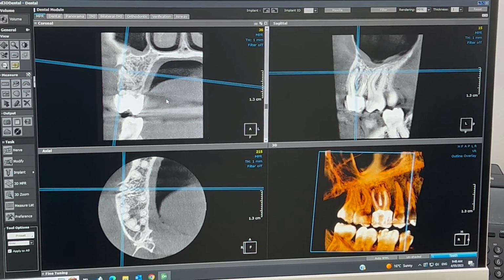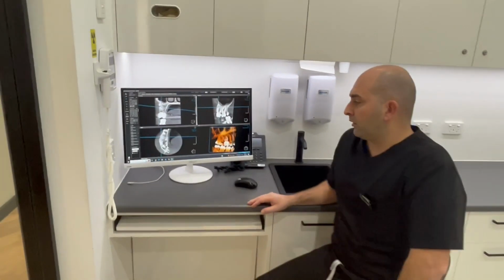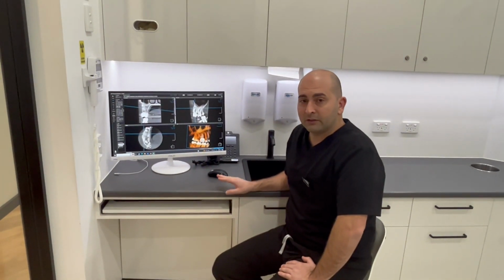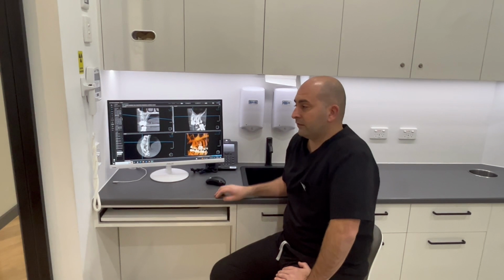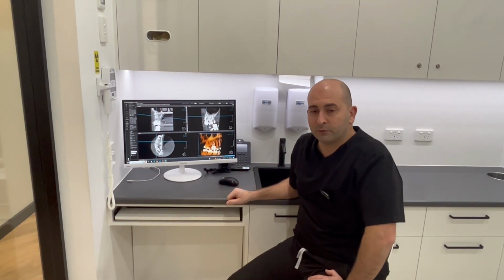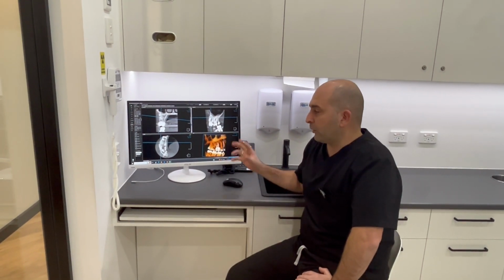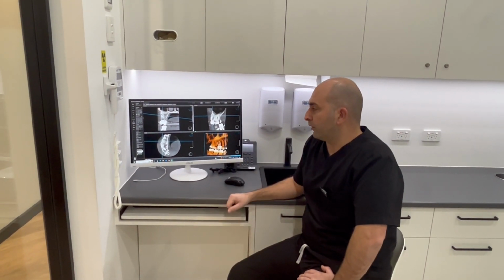The patient had reservations about taking the tooth out or continuing treatment, so she wanted us to run it past her dentist overseas, which is easy to do. We took a screenshot, sent it off, emailed it, and within a day he had responded to his patient and she went ahead with her treatment. So it's a really good way of showing how that digital flow works as well.